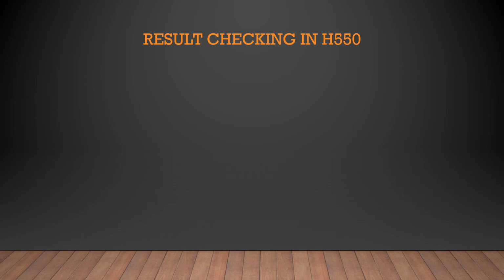Welcome technicians. Today we look into how to see the results in our hematology instrument, both today's results and the older results in the instrument. First and foremost, we have to understand that it will remember around 10,000 reports for the patients. After the 10,000 reports, it will start deleting the older reports and start adding the new reports.